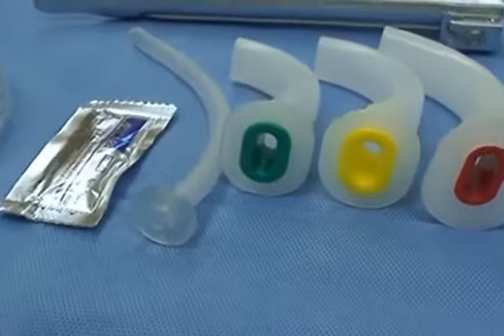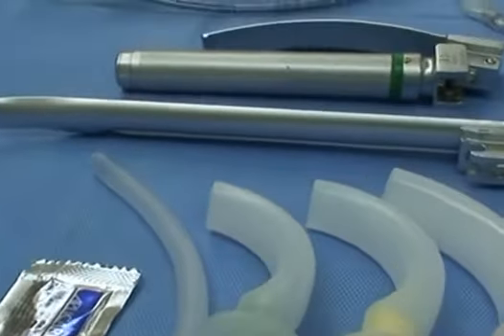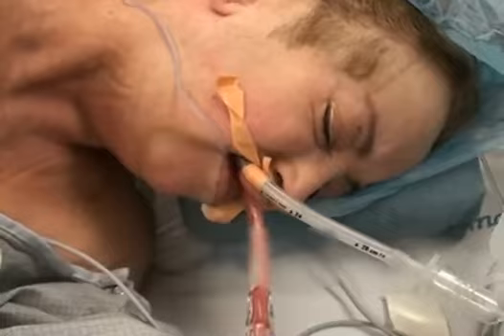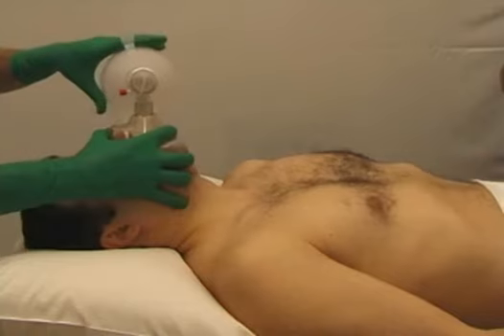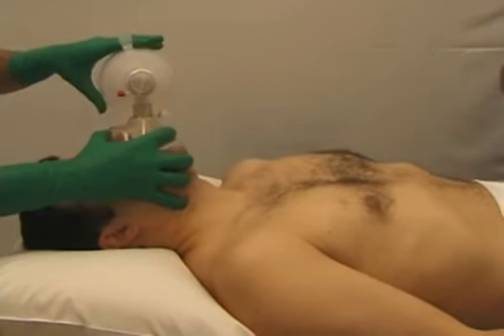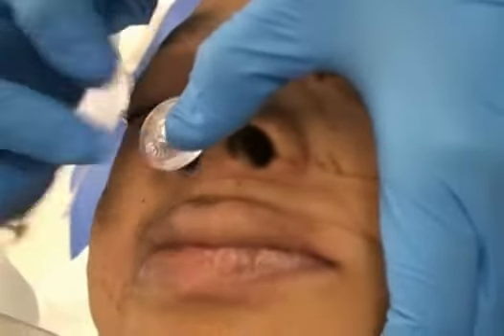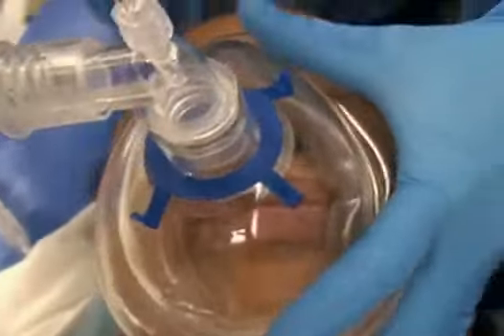Equipment selection is guided by the need to prevent complications and to maintain airway patency, oxygenation, and ventilation. A suction device for removing airway secretions, supplemental oxygen, and an appropriately sized face mask with a bag valve device must be immediately available. Oropharyngeal and nasopharyngeal airways should be readily available in case one needs to be placed to improve airway patency.